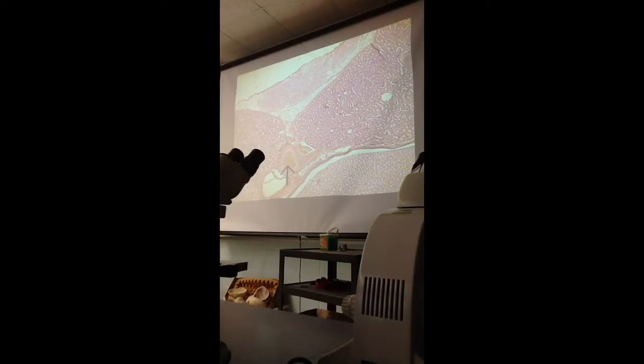What's that? The tip of the point. How does it look? It has some stuff inside, so it's probably a renal artery or a vein. It looks more like an artery, maybe a segmental or the main artery. So the peripheral part of the kidney.